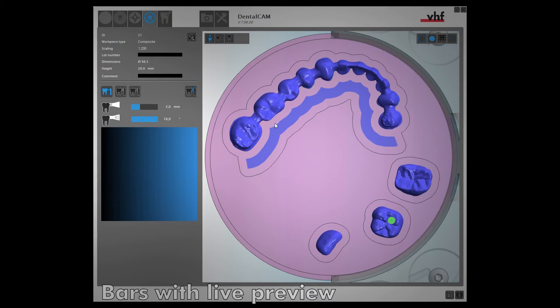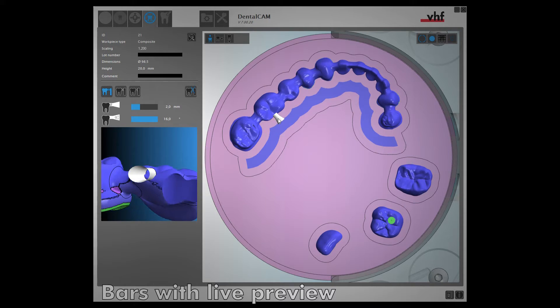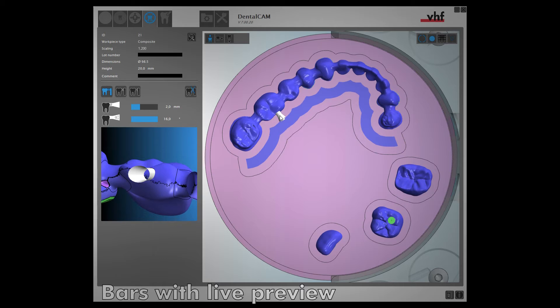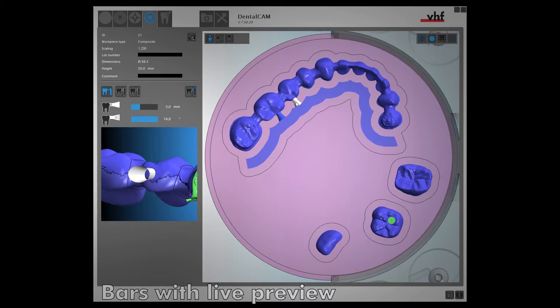Our live 3D preview enables you to place bars with greater precision. While you are positioning bars on the right, the preview window on the left allows you to set the bars perfectly every time.